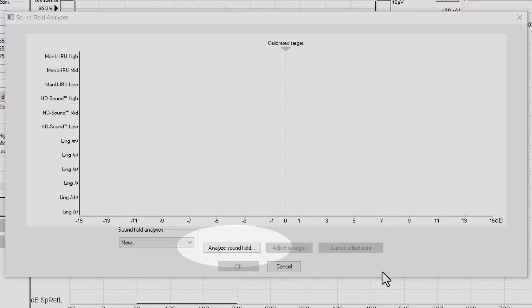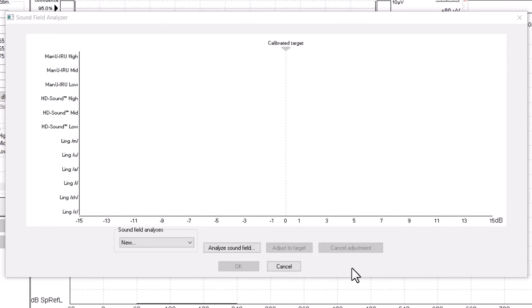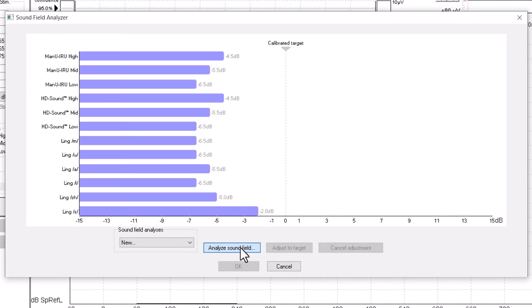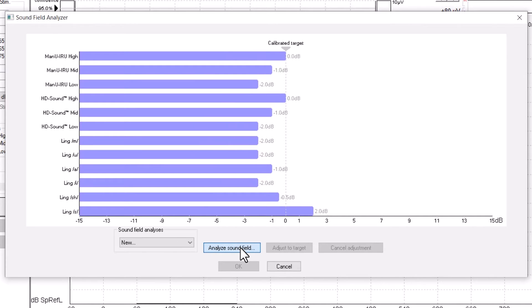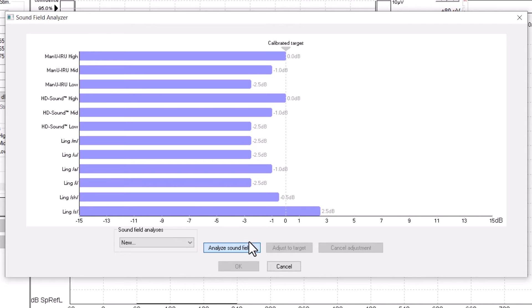Press Analyze Soundfield in the software. The speaker will then play a pink noise signal, and the software will measure the intensity of each stimulus compared to the calibrated target. Let the noise signal run for a few seconds, then press Analyze Soundfield again to stop the noise presentation.